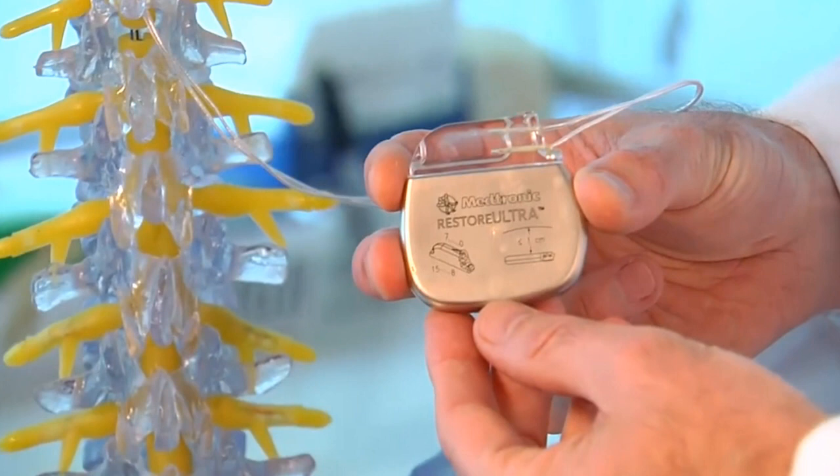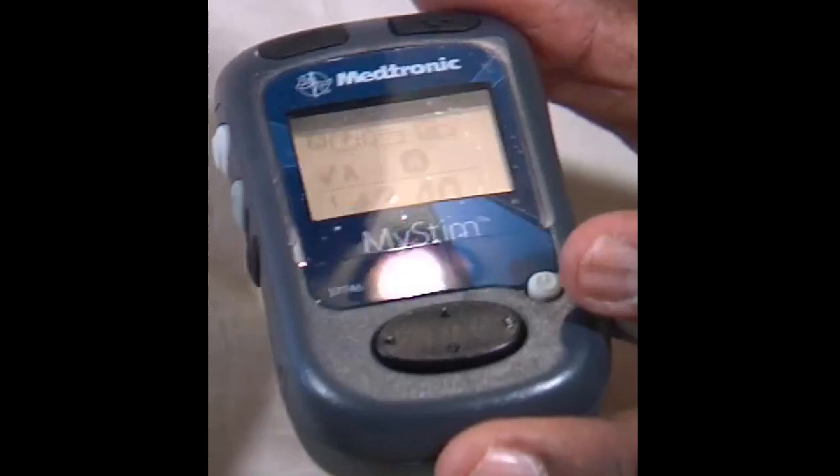There are three components to the DRG stimulator, just like the spinal cord stimulator. One, you're going to have a pack that is implanted in you, and this is what's responsible for sending out the pulses. Then, you'll also have lead wires that attach to the DRG, or the dorsal root ganglion, and you'll also have a handheld control, which can turn on and off the stimulator, as well as adjust the intensity.